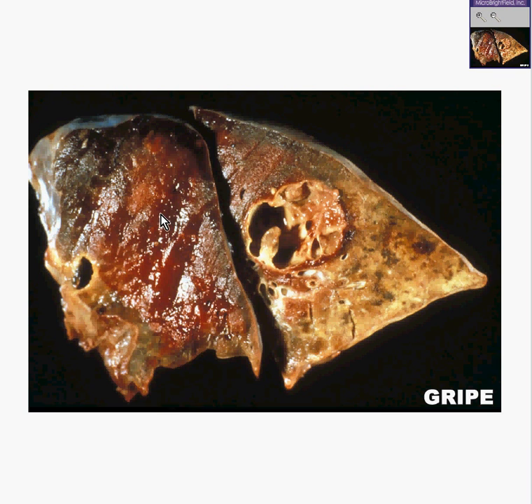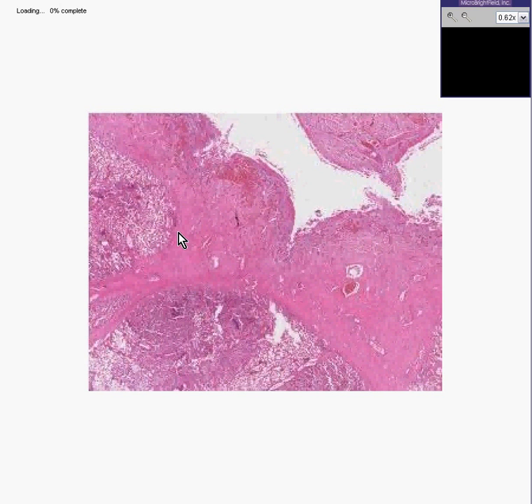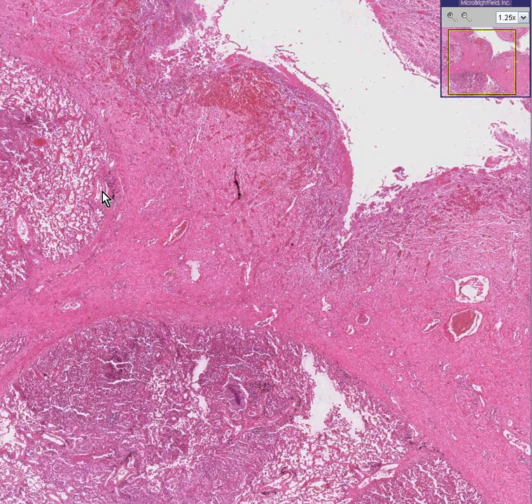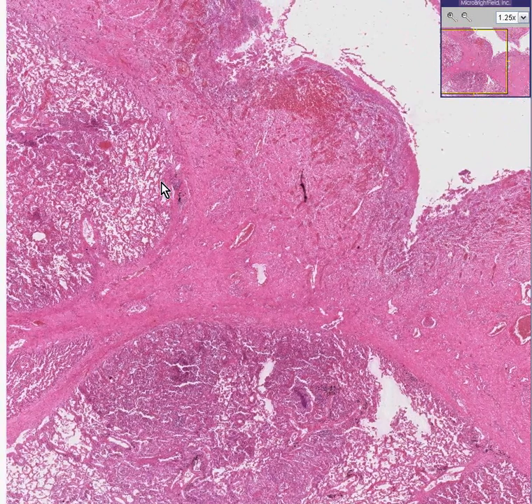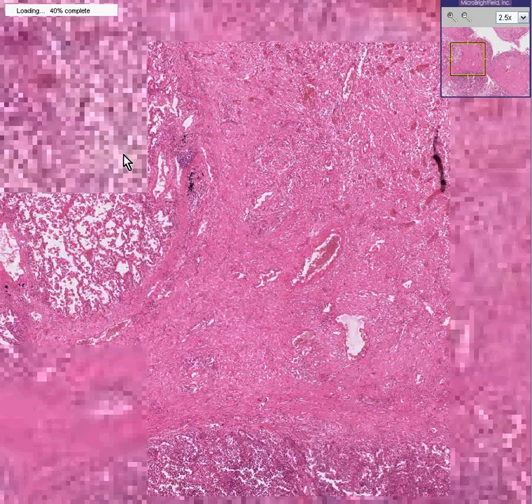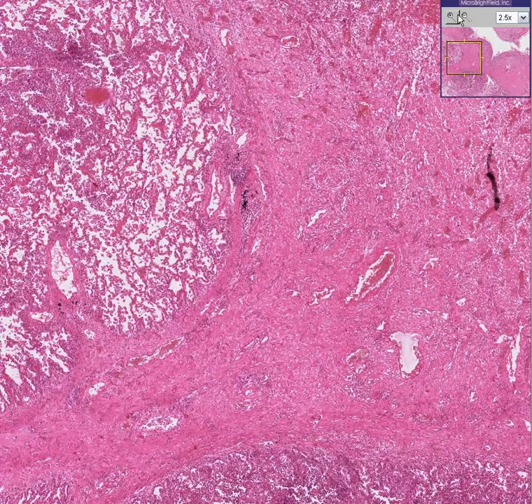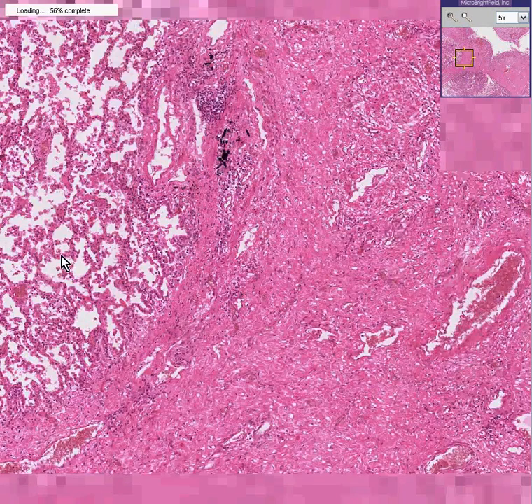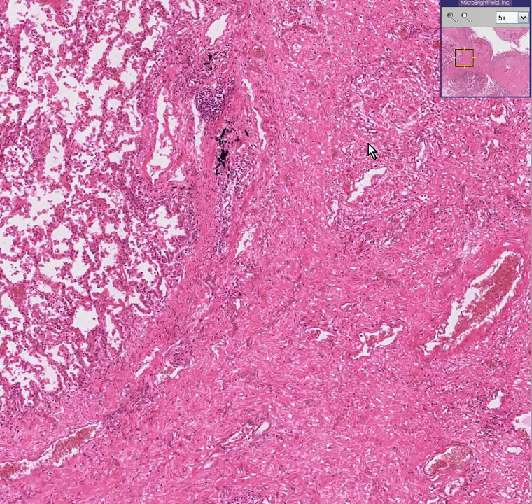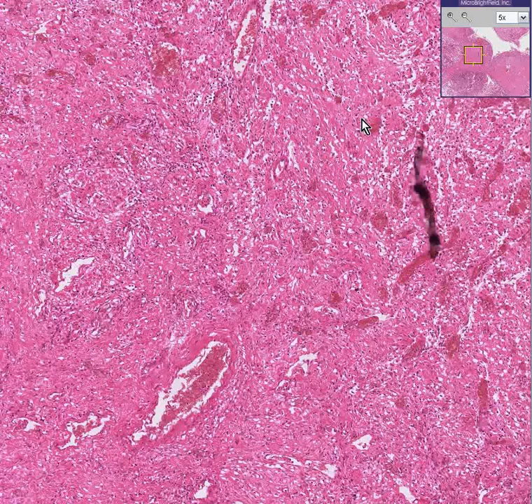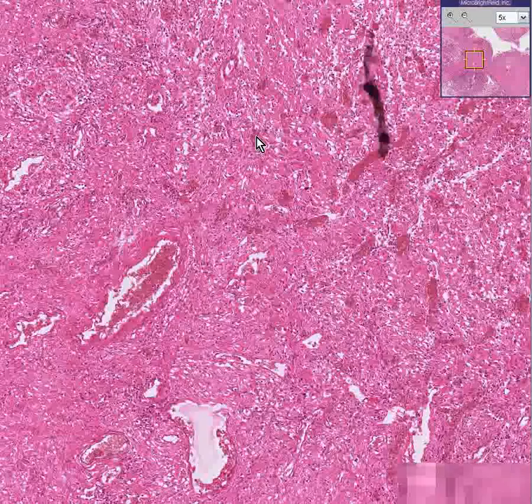So it would be what pathologists call consolidated. Let's look at it microscopically. We can see some area of lung out here, but the lung does not look terribly normal. It looks like there's a lot of cells and fluid edema, maybe blood filling up these alveoli, but at least we can recognize them as being alveoli. What we can recognize as this big thick fibrous area is the wall of the cyst or that big thing that we saw in the gross picture.